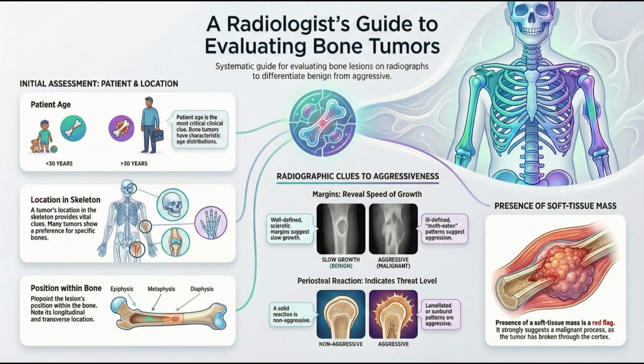N, non-ossifying fibroma. O is osteoblastoma. Do I keep going? M is multiple myeloma, though that's often permeative. A is aneurysmal bone cyst. S is solitary bone cyst. And H, I, C cover things like hyperparathyroidism, infection, and chondroblastoma. It just gives you this really comprehensive mental checklist. Got it. And the third type of density is just mixed, a combination of the two.